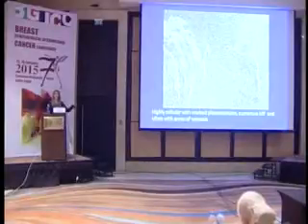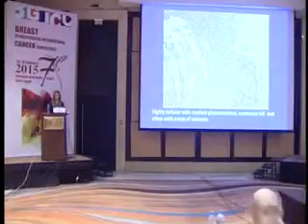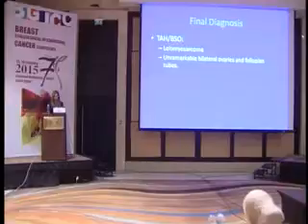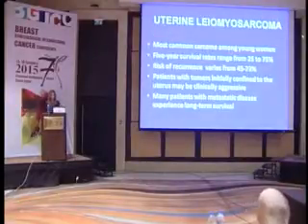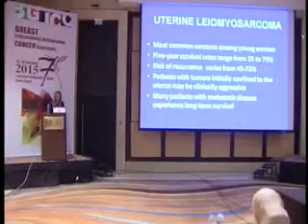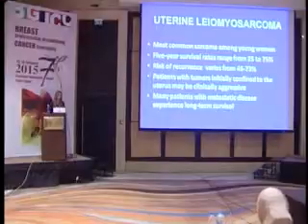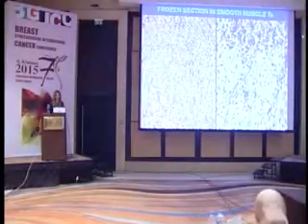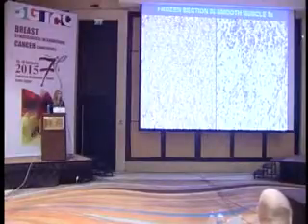Cellularity very high, significant cytologic atypia, and you got the tumor necrosis. So you need to have three of them. Okay. It's the most common sarcoma among young women, with 5-year survival from 25 to 75. It's really bad, very aggressive. And frozen section in smooth muscle, you have to see three of them.